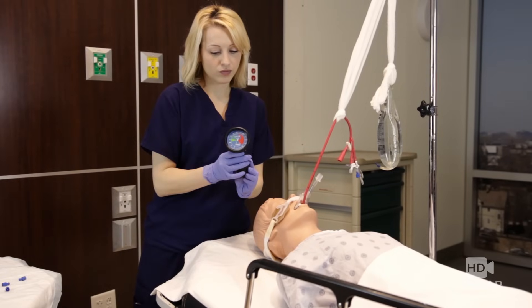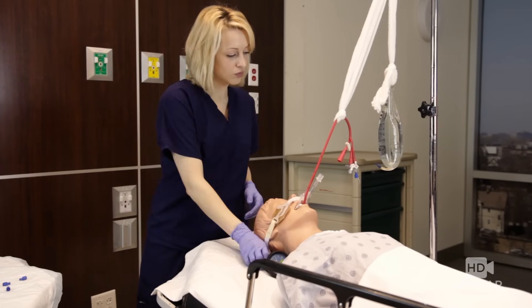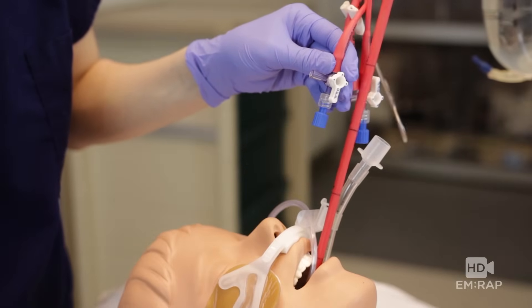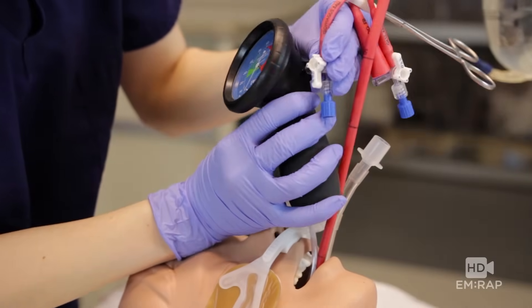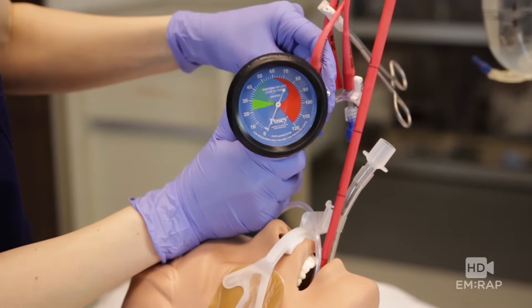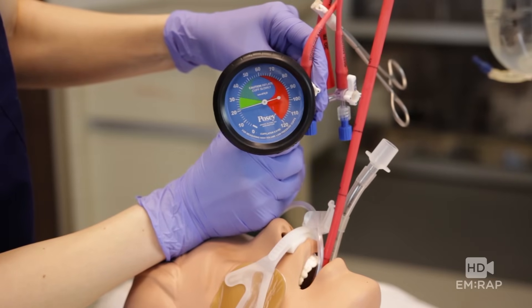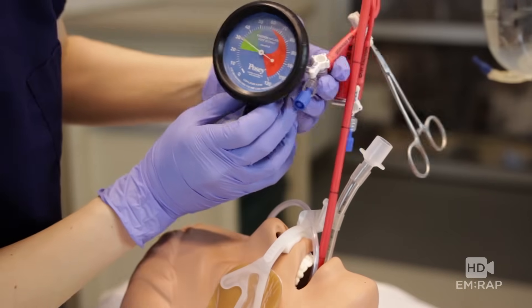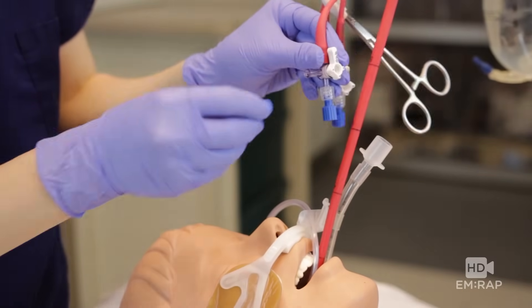Grab your Cufflator manometer and connect it to the three-way stopcock on the esophageal balloon port. Place another cap on the three-way stopcock. Remember, inflating the esophagus balloon is all about pressure, not volume. Connect the manometer, and when you squeeze the bottom of the Cufflator it inflates air into the esophagus. The goal is 30 millimeters of mercury — you can go up to 45 if you're not getting adequate tamponade. Once you're at 30, close the stopcock to off, remove the manometer, and place a cap on the remaining open port.